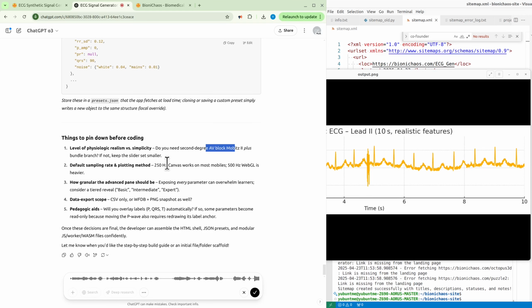Yeah, we'd like a canvas working on most mobiles, on most screen sizes. That would be great. Yeah, we do have to take into account that exposing every parameter can overwhelm the user. Yeah, we could have tiered reveal: basic, intermediate, expert. Actually sounds good. But yeah, we don't want to make the web application overly complicated as well. I assume the basic, intermediate, expert will be in separate tabs, would it? Any suggestions are welcome. At the moment, the data export, yeah, it would be nice to have a basic export function.